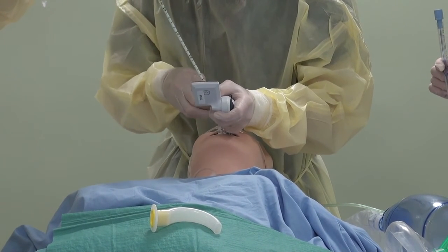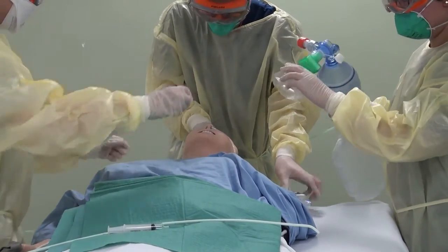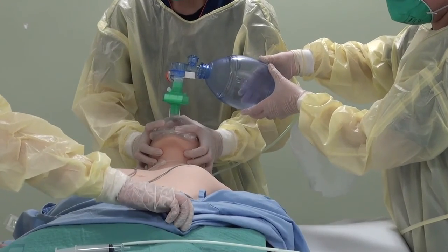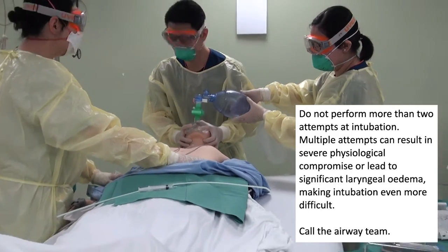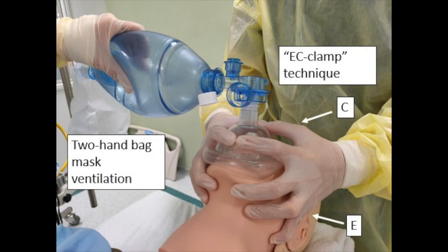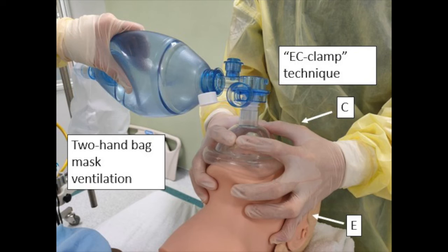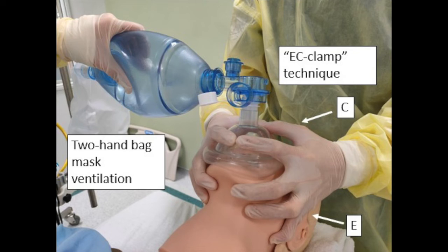When intubation is not successful, the next step is to provide adequate ventilation while awaiting for help. In a patient with suspected or confirmed COVID-19, insertion of a laryngeal mask airway is preferred. If you are not familiar with insertion of a laryngeal mask airway, then bag-mask ventilation can be provided with the use of an oral airway. Keep a good mask seal during ventilations and activate the airway team for help. If you are unable to intubate the patient, effective bag-mask ventilations may be life-saving. Patency of the upper airway can be achieved by using three fingers to lift the jaw, forming an E, and the thumb and index finger holding the mask to the face, forming a C to maintain a good mask seal.